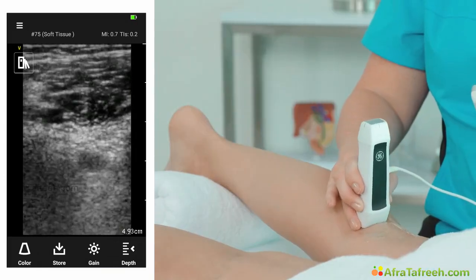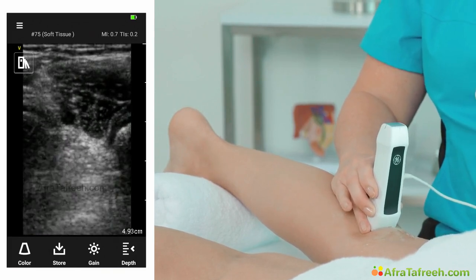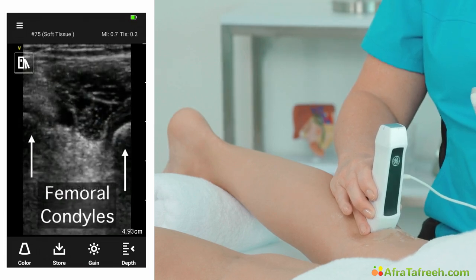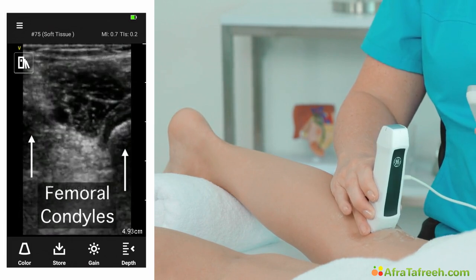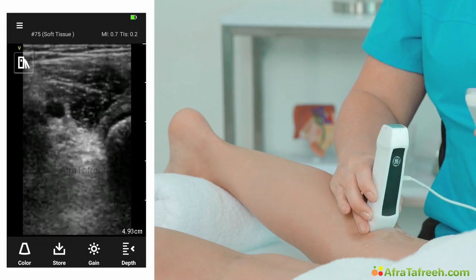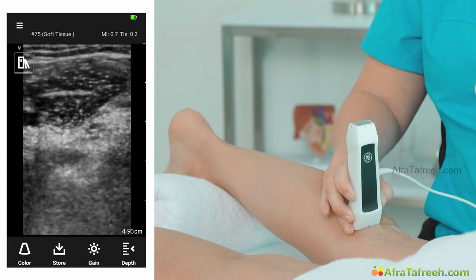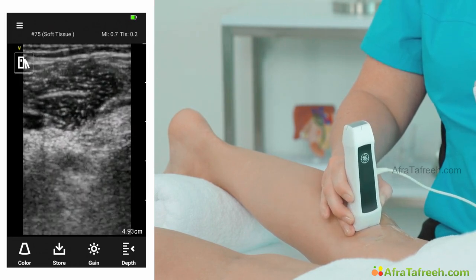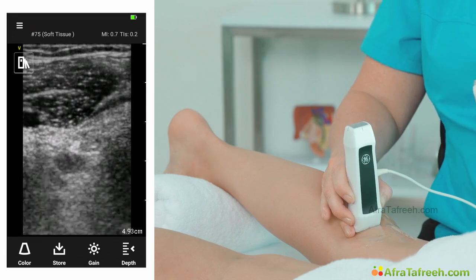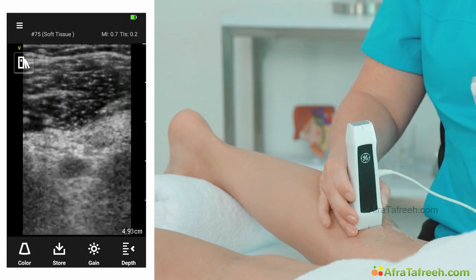Now I'm going to slide more into the mid part of the knee joint. Again, I've got the two femoral condyles on each side of the image, and I'm just looking for any fluid in that knee joint in the mid portion. Sliding up and down. And again, as I'm sliding through, I notice a small hypoechoic area deep in the image there in the middle, which is possibly a small amount of fluid. And that's probably the connection with the small Baker's cyst that we've seen medially.